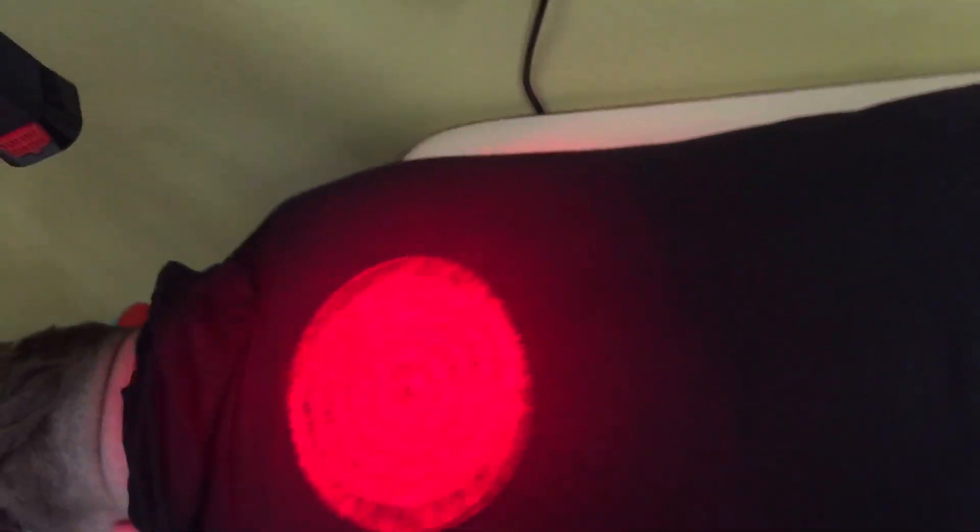So this is the technique we're using on Dylan, and I'm going to turn this instrument off right now because we've already successfully lasered and rebalanced his legs. After about 20 seconds of lasering, he should be out of pain. The pain diminished at all, Dylan?